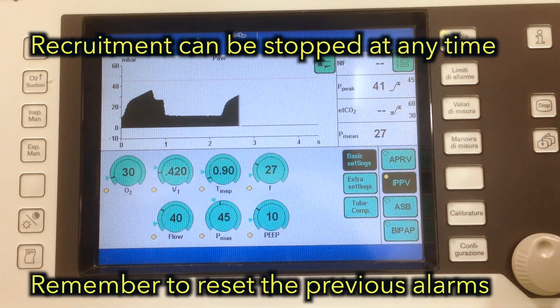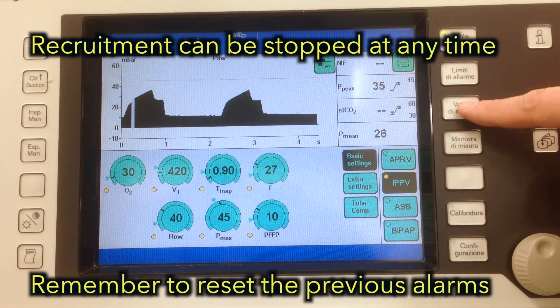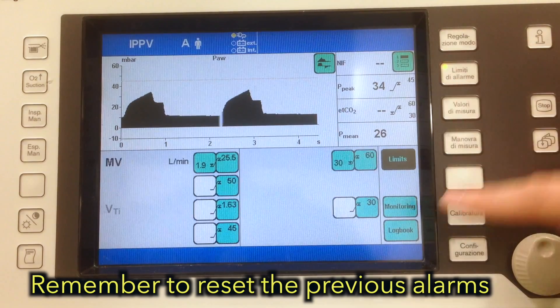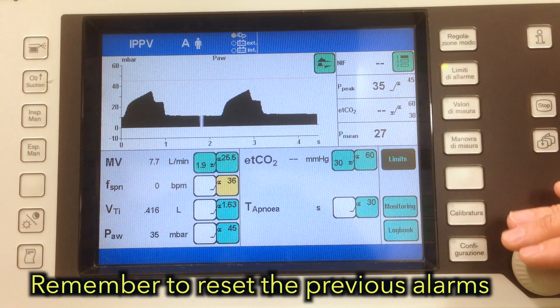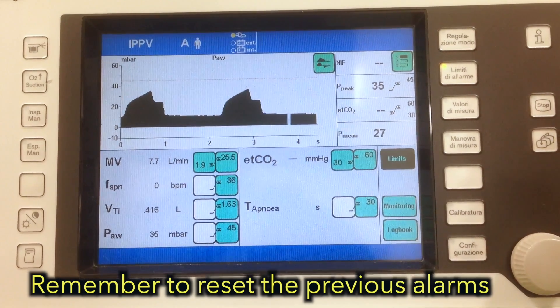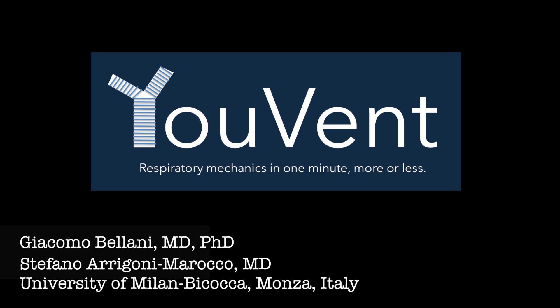Once you are done, remember to reset the alarms to your original settings. Now, let's go.